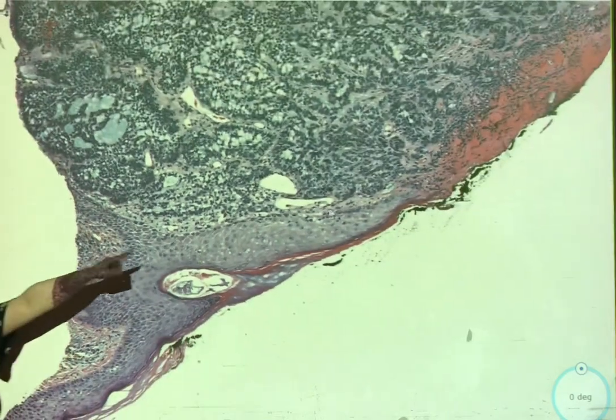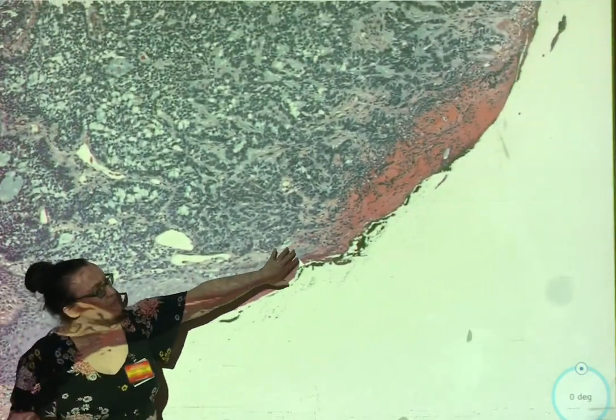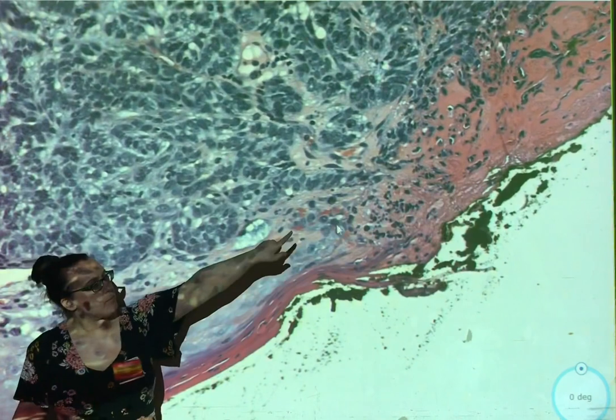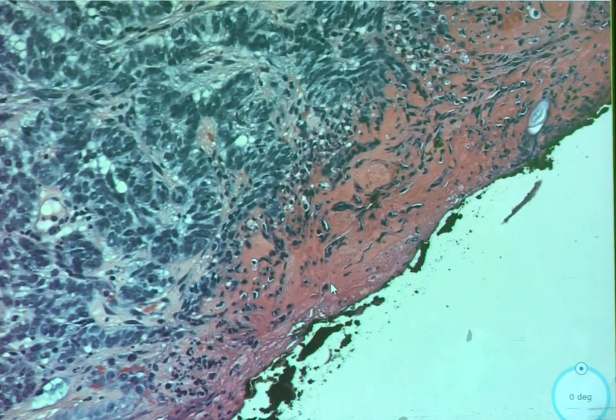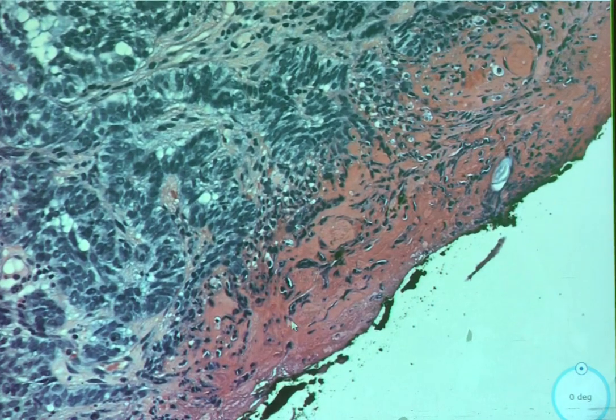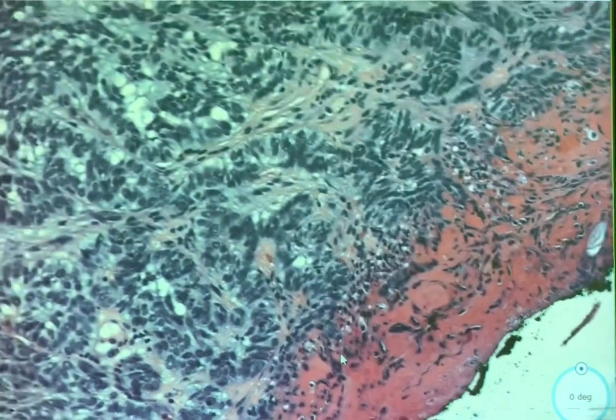If you go a little bit this way, what happens to our epidermis? Over there. All that pink stuff. It's going more ulcerated, more collagen fibers here. Yeah, it's gone, right? So this is probably an ulcerated lesion. Okay, so now you can look at the cells to your heart's content and tell me all about them.